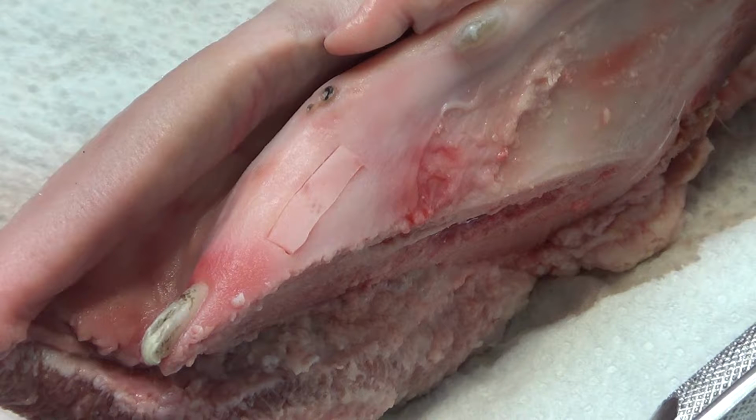My cheeks very thin. I made this kind of, but this one too thin. Yeah, but no problem. No problem. Yeah. And this was the first, the second. Perfect. It's absolutely perfect because you have a really thin tissue there, but it's okay.